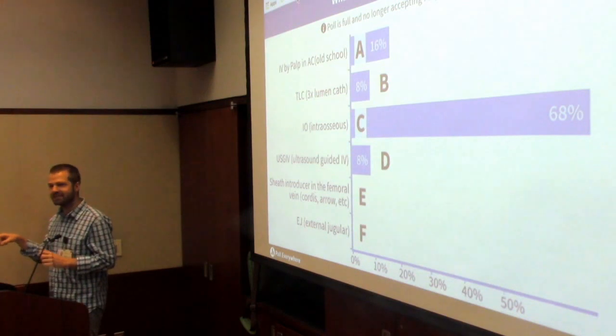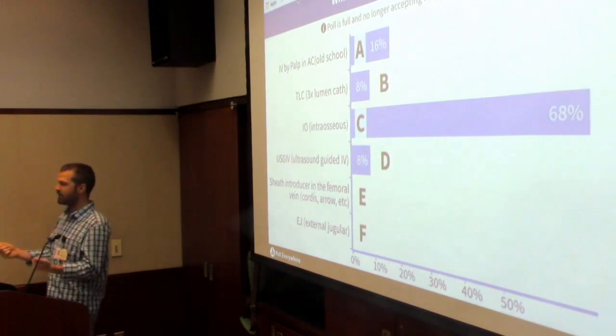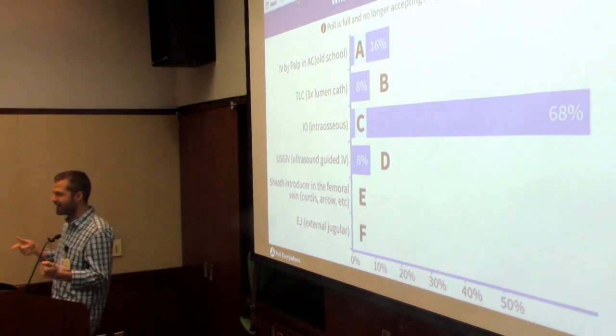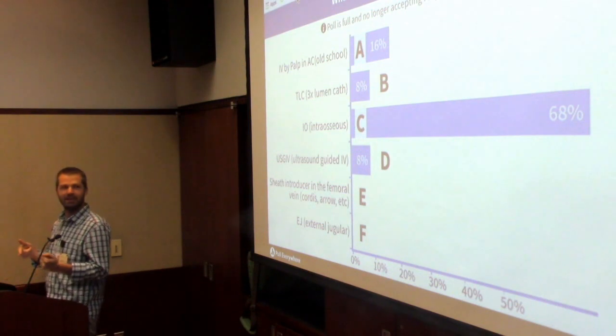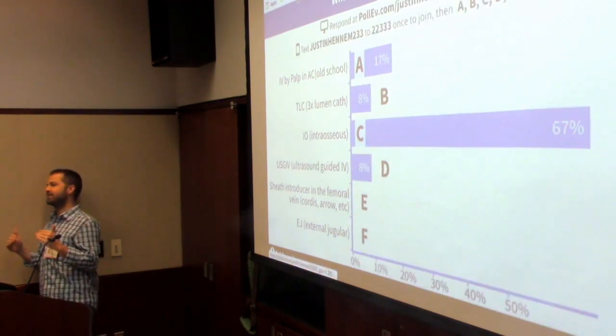You're like, hey, where's the IO? Where's the IO? And then you finally open it up and there's 3 sizes and you go, I don't know which one to use. And you arbitrarily pick a needle and then you kind of stand there waiting like, now do I go? Now do I go? So all that matters is whatever you can do fastest.